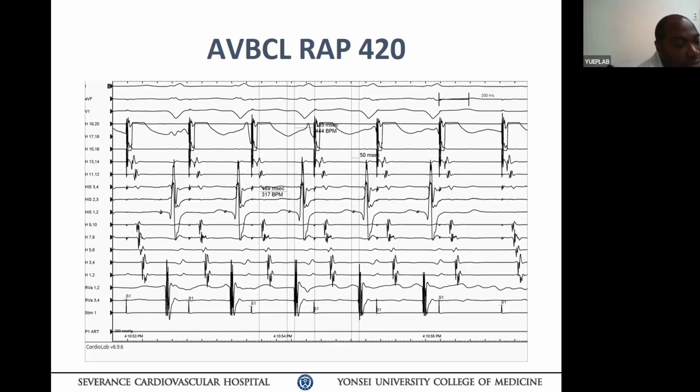And the second question: on RV pacing, was the concealed left lateral pathway apparent? No, not until the tachycardia was induced. So you mapped and ablated during tachycardia. Yes. So if it's a nodoventricular pathway, why didn't you ablate it as well? The nodoventricular pathway is just a bystander. No tachycardia was induced at the left lateral pathway ablation.